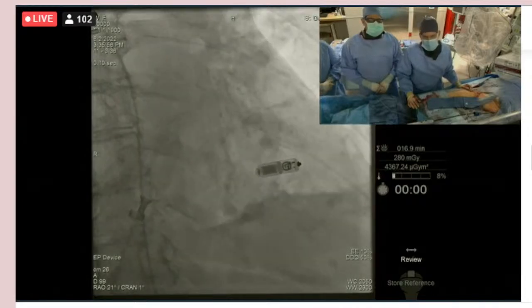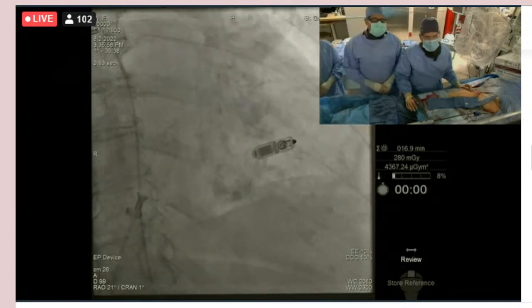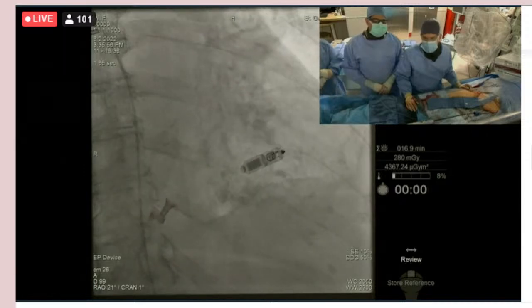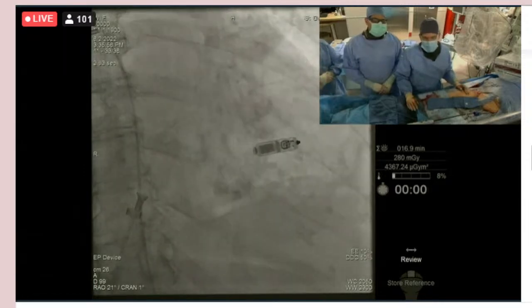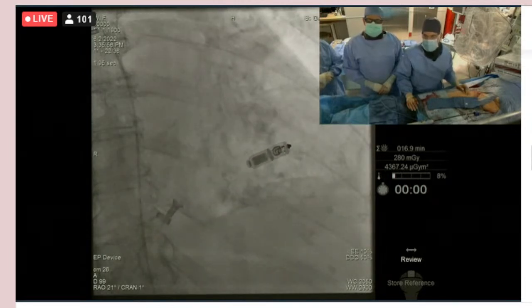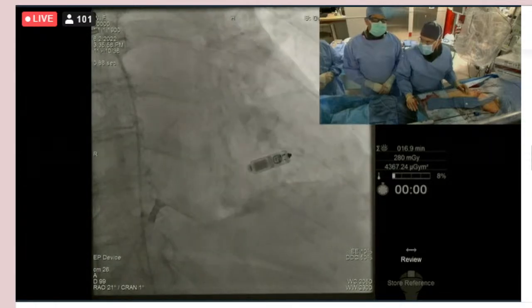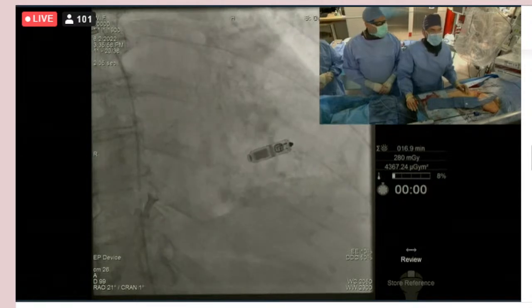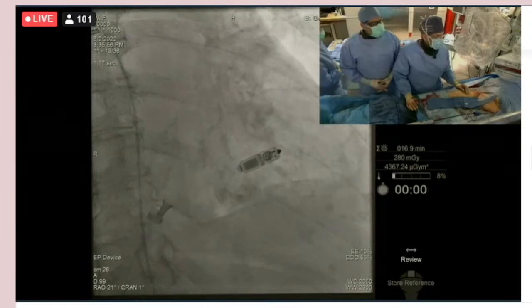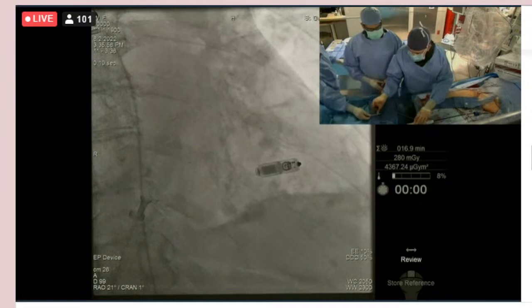And one of the things I'll point out is I'm doing an AV node ablation on this patient, and unless that threshold is sub 1, I don't even ablate because if I left it with a higher threshold, this battery is just not going to last because it's pacing all the time. So you might wait a little bit, see if the numbers get better, and then do it? Yep. Well, so I'm going to cut now. Okay. How many of these have you had to retrieve, and how do you find retrieval of these?